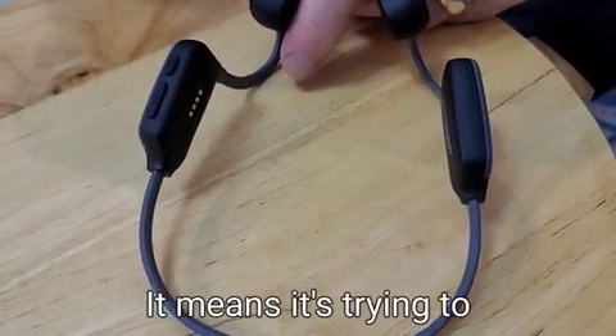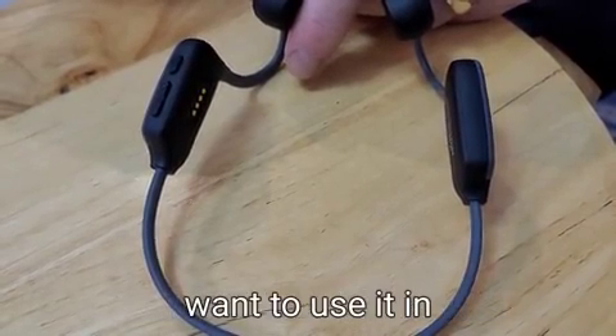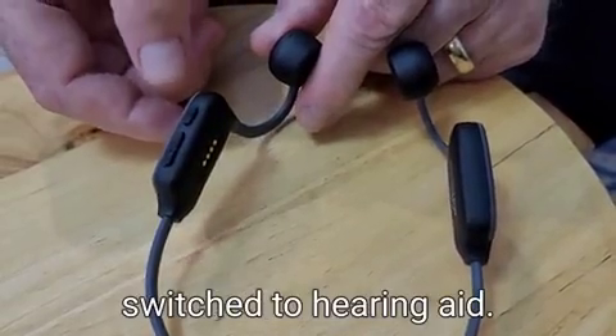Pairing means it's trying to connect the Bluetooth to another device, which is not what you want when you want to use it in hearing aid mode. So you click quickly one, two — now it's switched to hearing aid.